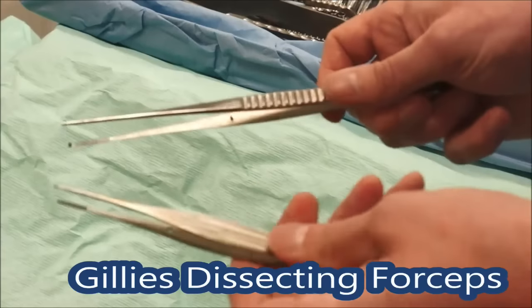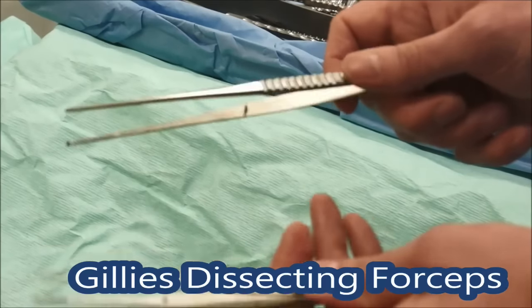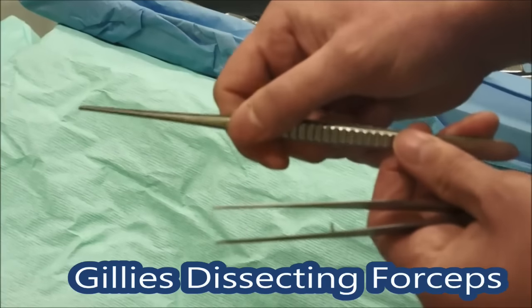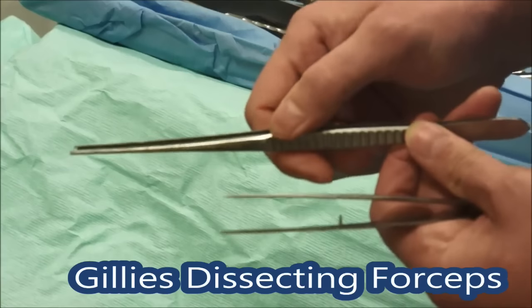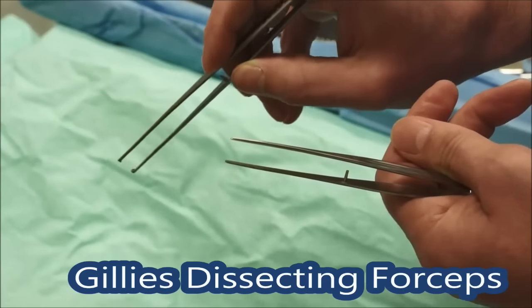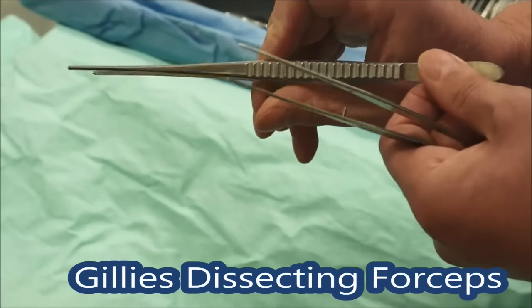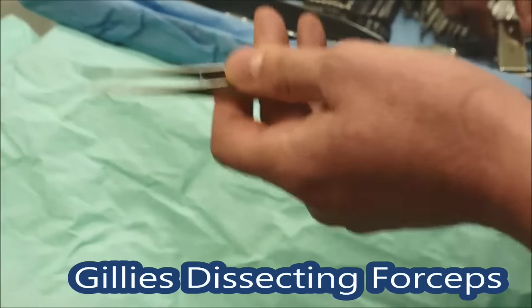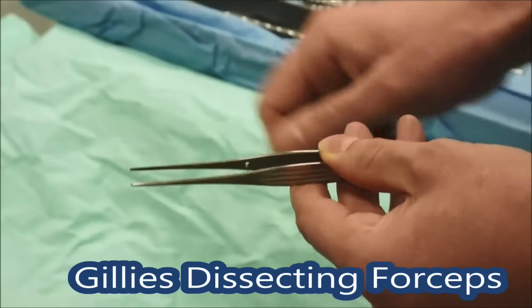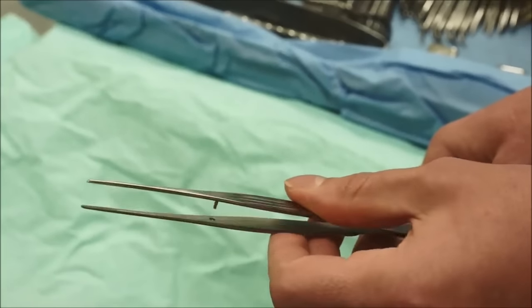Now we have a couple of pairs of forceps named after Gillies — lots of instruments in theatre are named after plastic surgeons. These ones have got teeth and are a little bit longer than you often find on a tray, but they're very good for skin closure. The teeth help you hold up the skin — you should never press too hard, and a plastic surgeon will get very upset if you squeeze the edge of the skin. Those are toothed Gillies. For even finer work, here's a smaller version without teeth, quite good for small retraction and delicate holding of tissue.